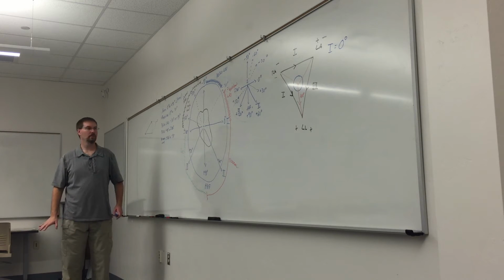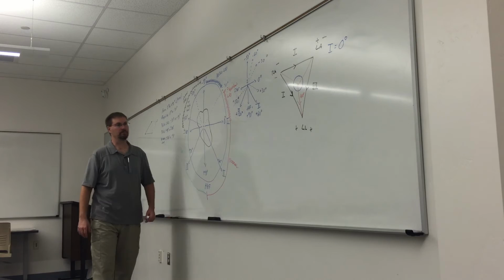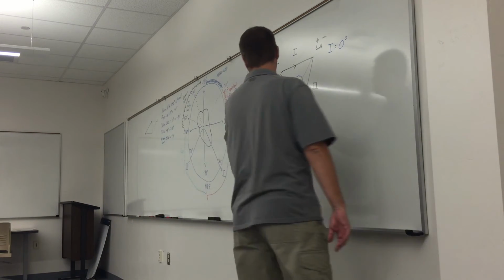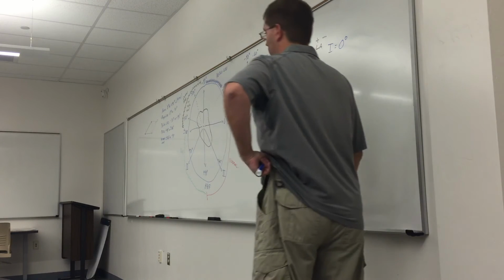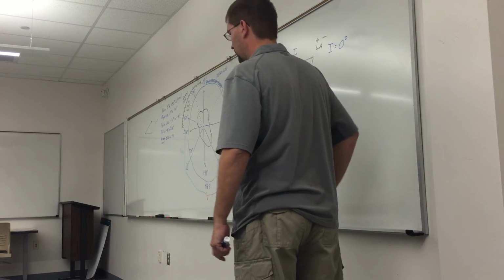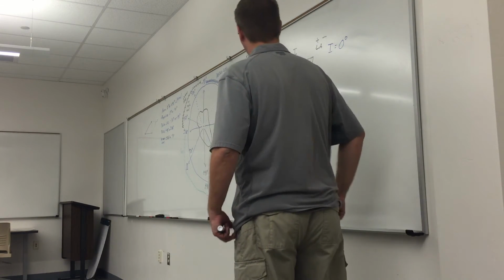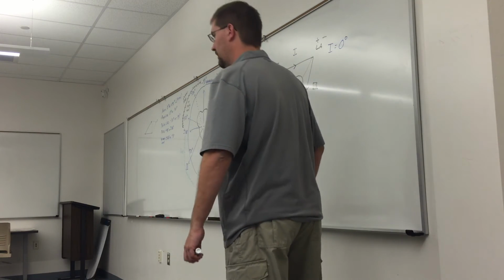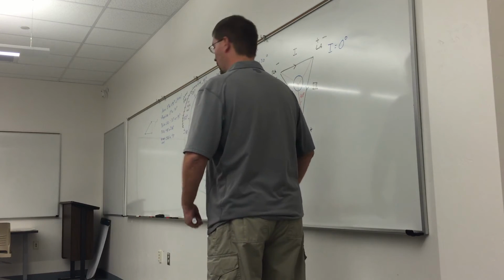I got a quick question. Yeah, go ahead. On this triangle over here, what exactly am I looking at? I understand that this is like a disc that I put here. What is that triangle? What am I looking at? The triangle? You're looking at how it lays on the body, just like that. Same way? Yeah.